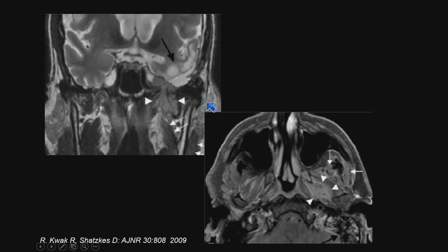Here's an interesting case — a 53-year-old patient with a history of glioblastoma. Rarely, glioblastoma will metastasize to bone, liver, lung, or lymph nodes, but here's a case where it actually extended through the foramen ovale into the masticator space.